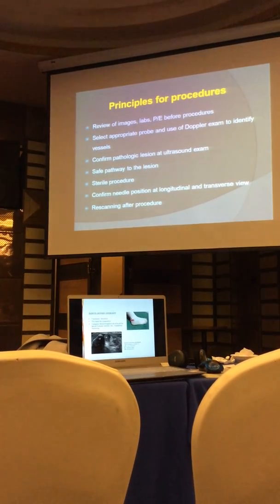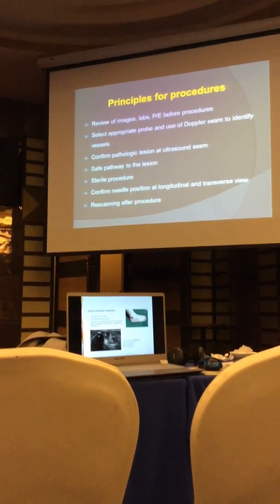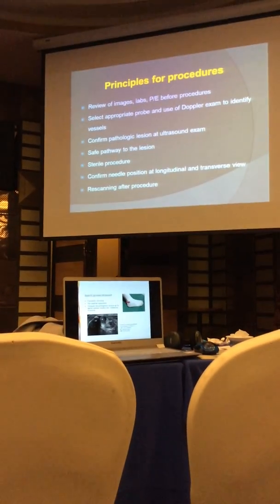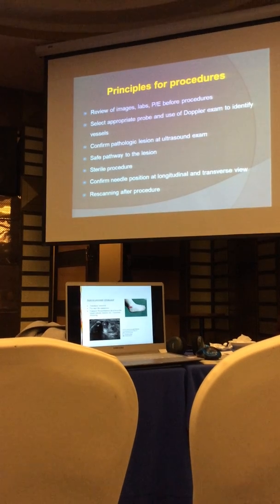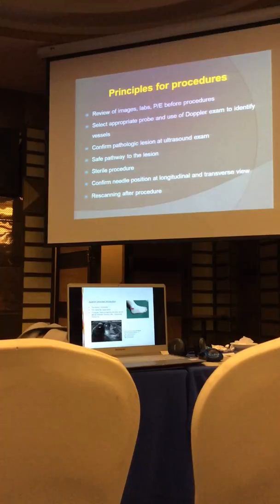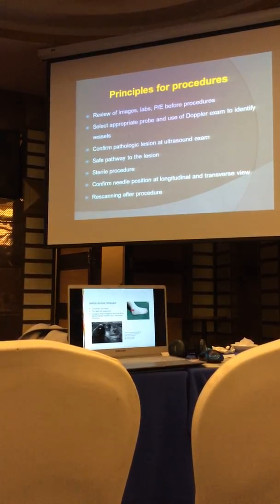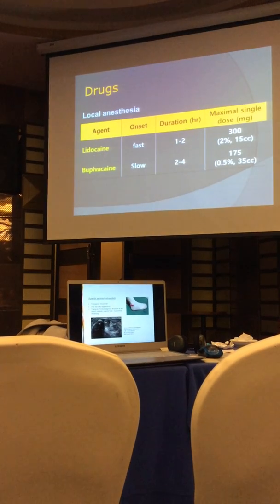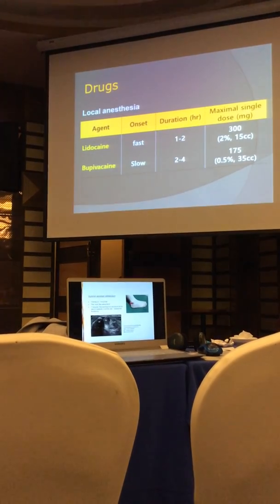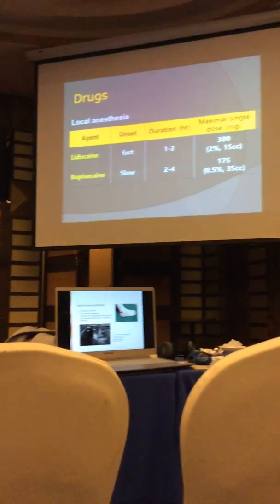Clean the site with betadine or for hygiene. You have to confirm the needle position in both longitudinal and transverse views. And make sure after the procedure you do rescanning to make sure there is no hematoma or complication after the procedure. For local anesthesia, you could use lidocaine or bupivacaine.